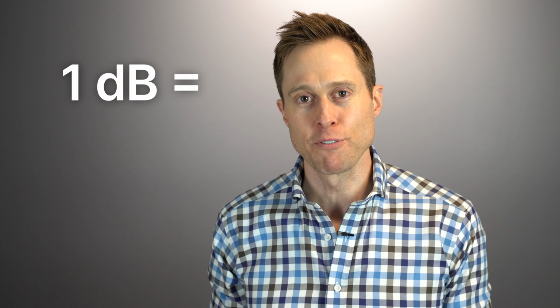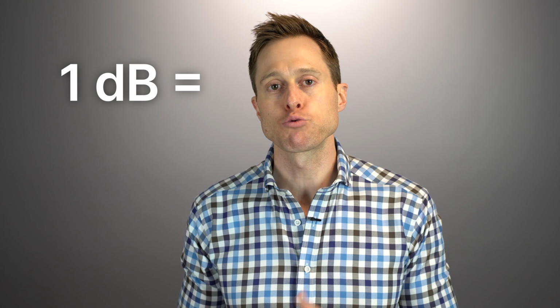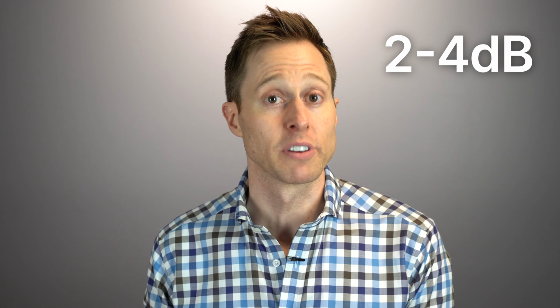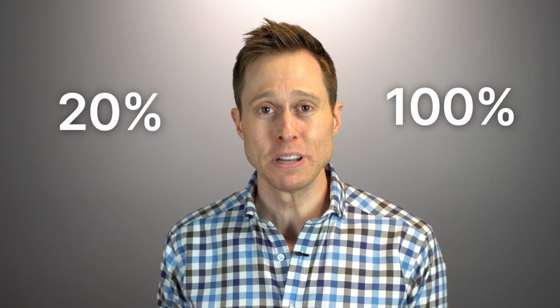Now, the rule of thumb with this is that every 1 decibel of improvement created by directional microphones is roughly equivalent to a 10% improvement in speech understanding. Some of the best hearing aids in the world may be able to give you up to a 10 decibel improvement in signal-to-noise ratio using directional microphones, but this typically requires that you use a closed dome. However, most data out there suggests that directional microphones can give you only between 2 and 4 decibels of improvement. Still, when you consider that directional microphones may be able to give you anywhere between 20 and 100% improvement in speech understanding in a background noise situation, that is huge.